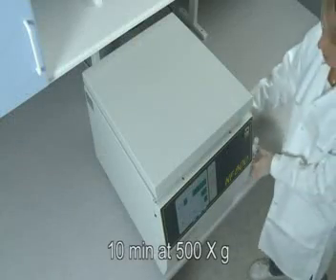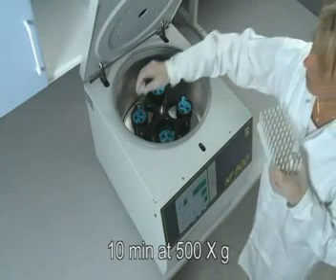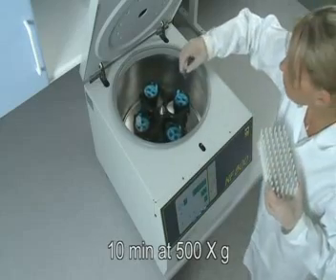Centrifuge for 10 minutes at 500 times G. Calculate the correct RPM for 500 times G for your centrifuge.